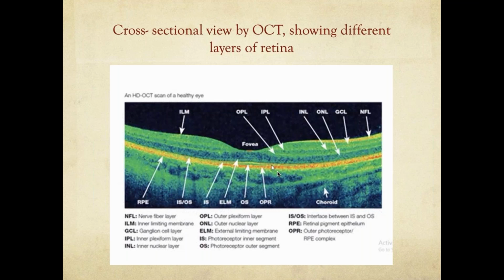thing is you order an OCT, but if the OCT is, for example, most of the times the only reason why a clinician or anyone sends an OCT is to see if there is edema or if the RP is normal or not.